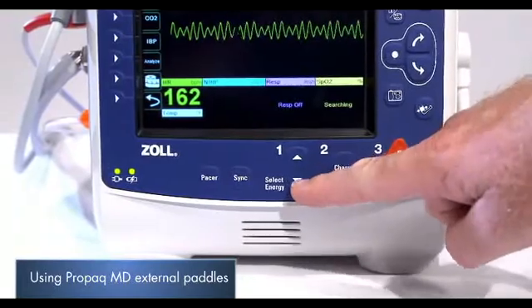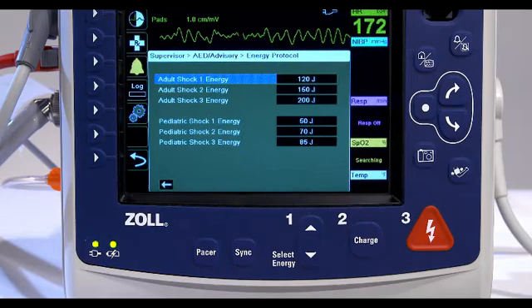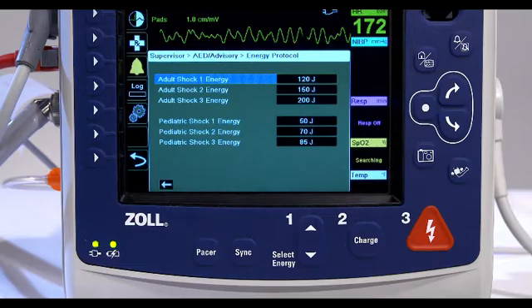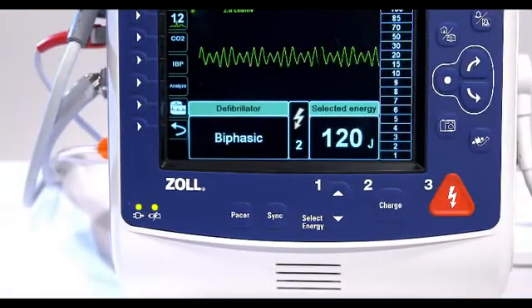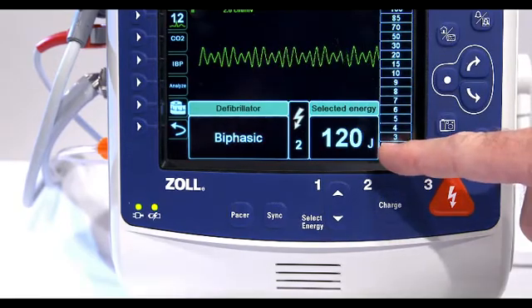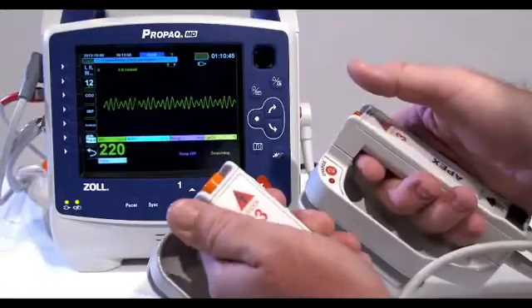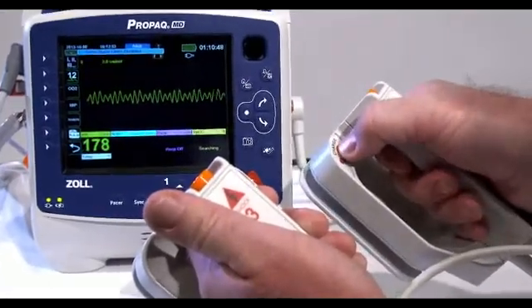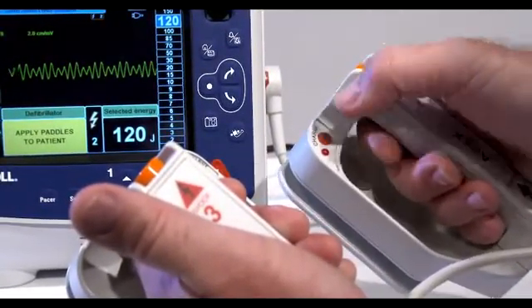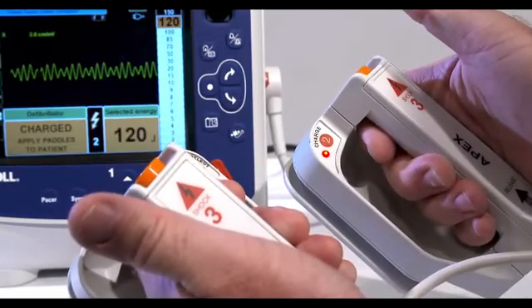The default energy selections are: Adult 120 joules, Pediatric 50 joules, Neonate 50 joules. Defibrillator energy levels should be selected based on site-specific protocols. The selected energy level is displayed at the bottom of the display screen. Press the charge button on the apex handle or on the front panel. A charging message displays at the bottom of the screen and a distinctive charging tone sounds, indicating that the unit is charging.